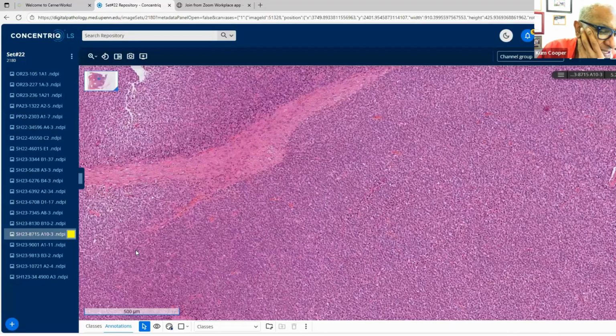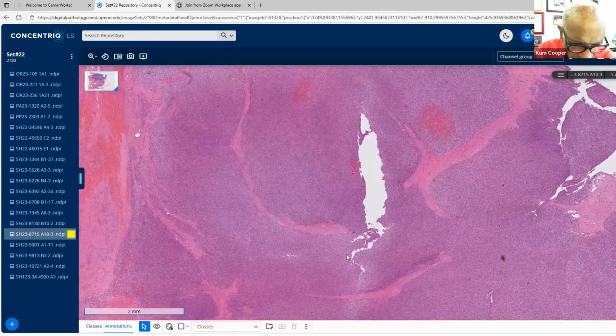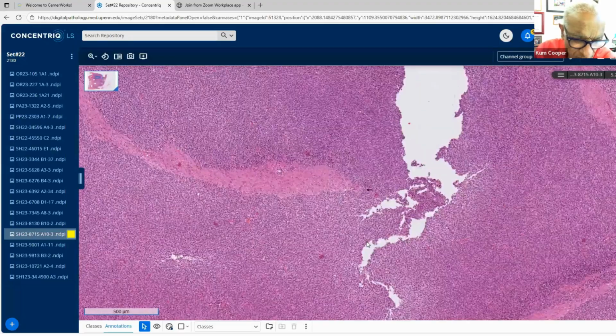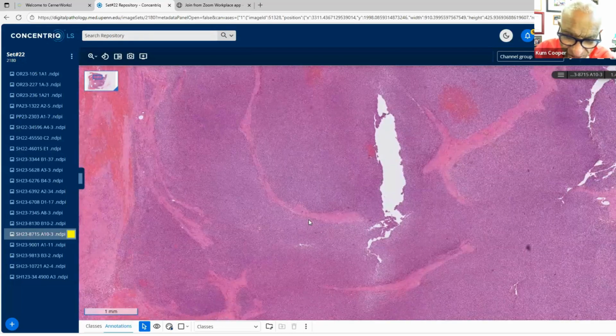And you can read about the DDIF like SFTs in there, and they talk about loss of CD34 and loss of STAT6 in the dedifferentiated areas. So be careful, because if you get a needle core biopsy, you may not see the typical SFT areas to make that diagnosis or help you make that diagnosis. In their paper, there was a small subset that did not have usual SFT morphology. So yes, that would be a good thought here. And like I said earlier, CD34 was negative and STAT6 was also negative.